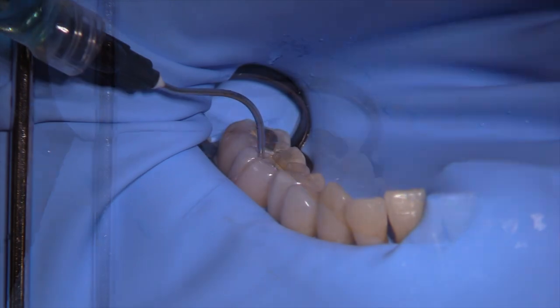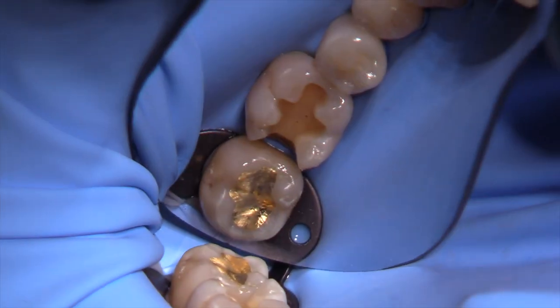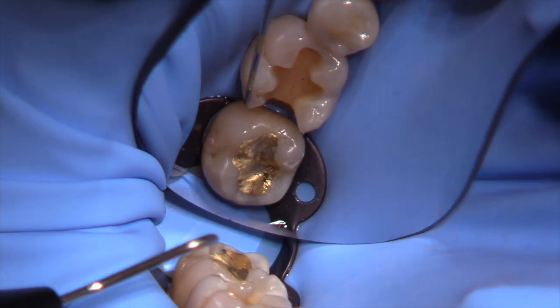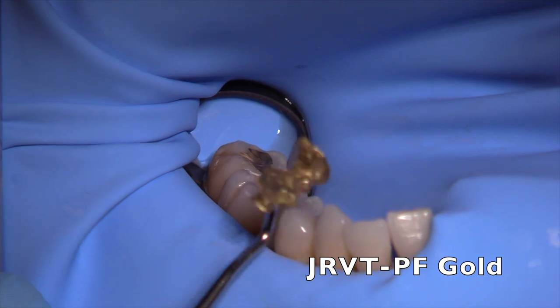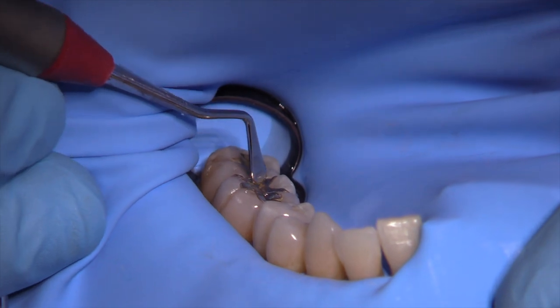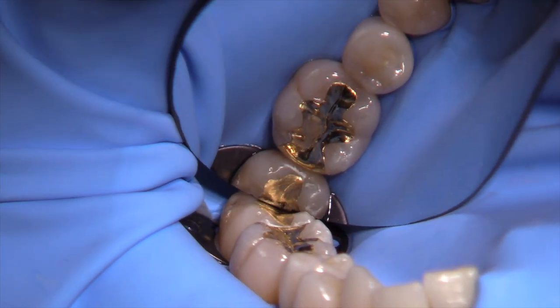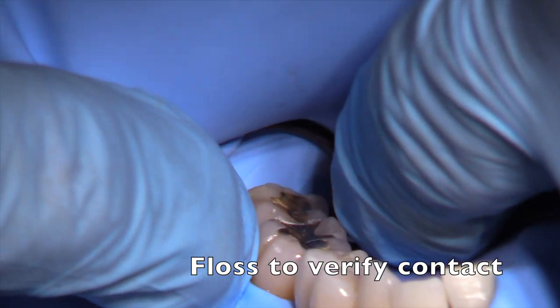If you floss properly, the dam will stay in place. We're now going to use chlorhexidine 2% scrub to clean out the cavity before we cement the inlay. You'll notice that I cemented the occlusal on the second molar earlier before the video. We're going to try in the inlay, which is made from JRVT palladium-free gold made by Jensen Industries. We can push it all the way into place. Notice that the margins have been left unfinished by the laboratory on purpose — I made the inlay with this in mind.